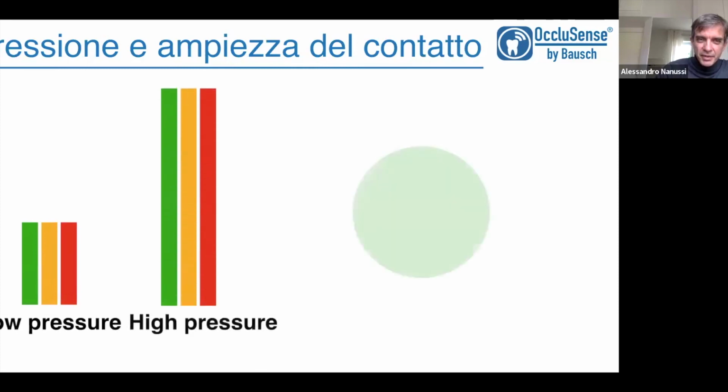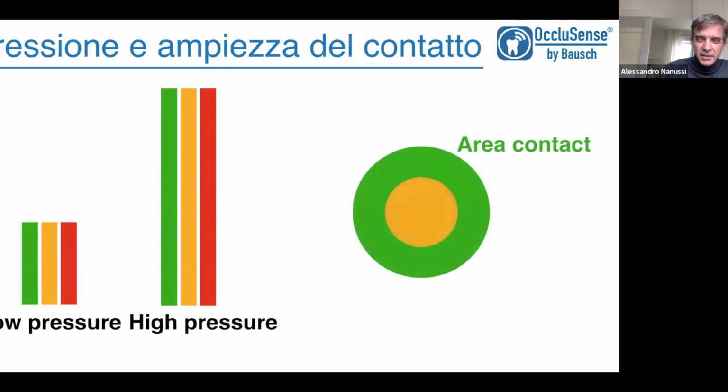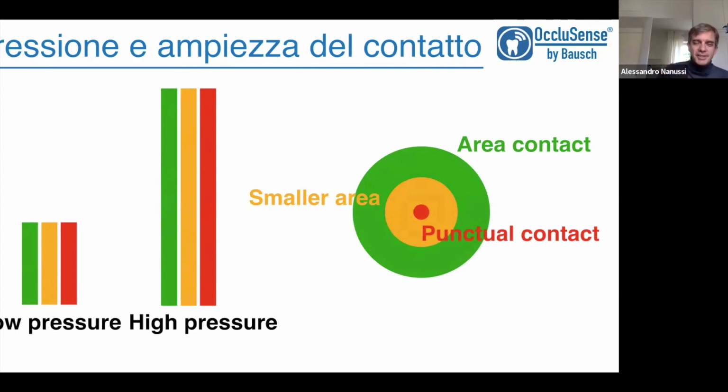It means that if I see only punctual contact and red spikes, I have a patient who has only points of contact. So I have all the force, all the load, in a single punctual contact. This could be dangerous for the resistance of my prosthodontic treatment, of my ceramic treatment, for example. In this case I need many punctual contacts, because I need the load to be distributed over many of them.